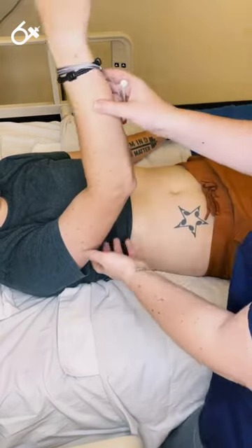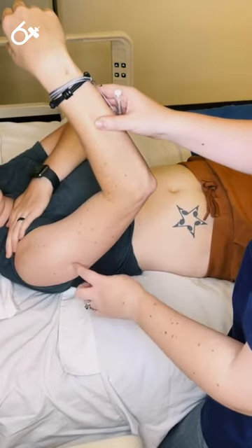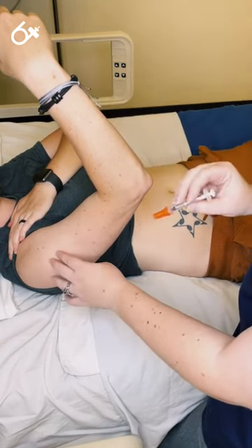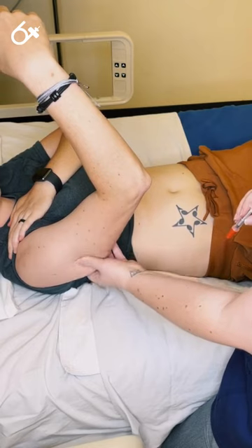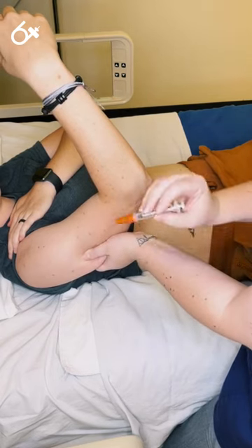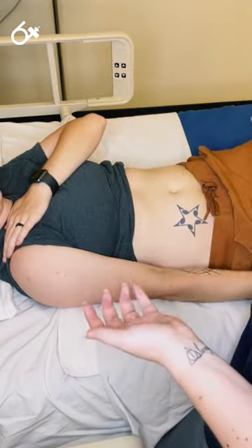Another good place is going to be in the back of the arm. Now, this is very different than doing a deltoid injection — that's your intramuscular injection. So when giving a subcu injection, I'm not going in that same place. I'm coming down to this bottom part that I like to call my 'bat wings,' and I'm pulling it out away from the patient to make sure the needle goes into the subcutaneous tissue.